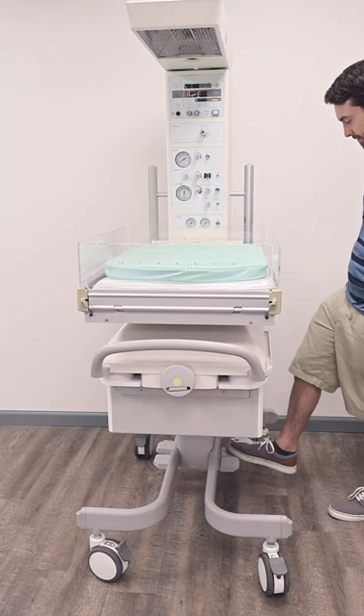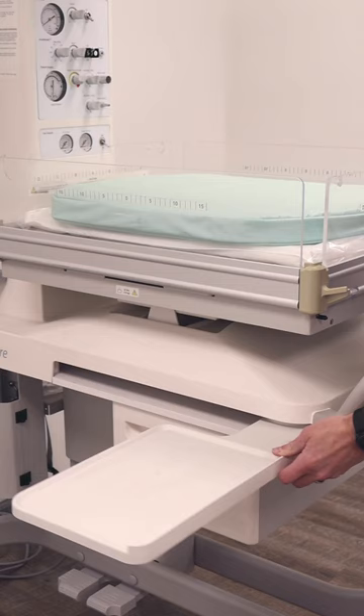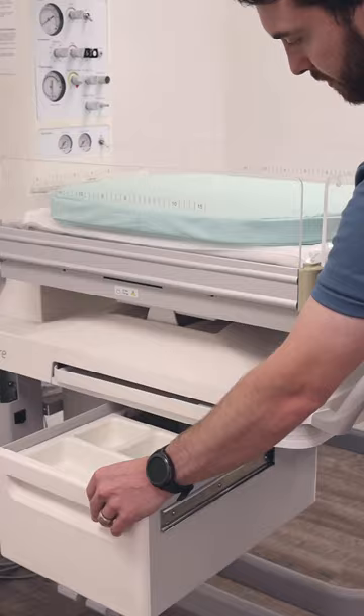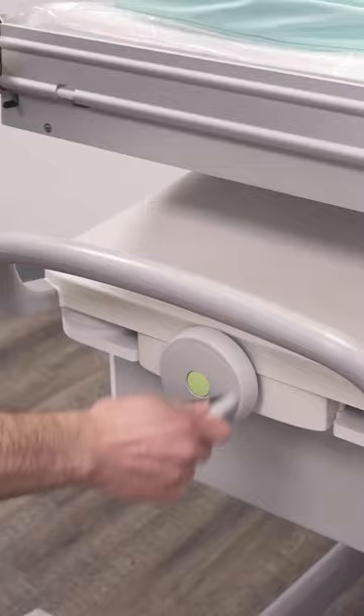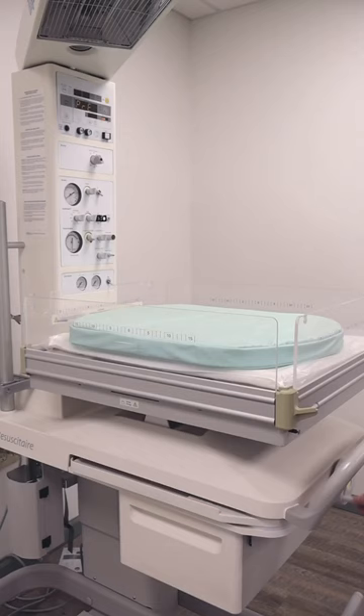Soma offers capital medical equipment up to 50% below the cost of new, with the same service and warranty as the manufacturer. Soma not only offers infant warmers, but over 60 different categories of equipment. For more information or pricing on any of our infant warmers, call 1-800-438-7662 or visit somatechnology.com.